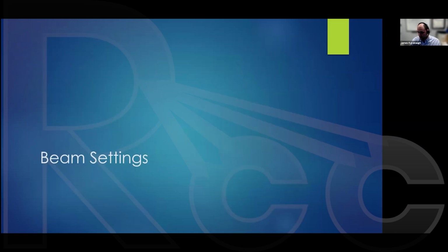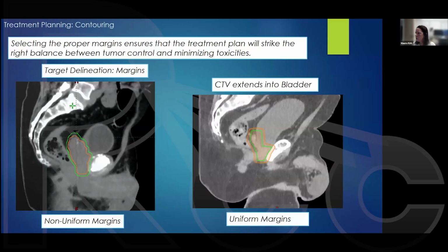All right, jumping into some beam settings, unless there are questions that have popped up. We did have a couple of questions about specifics of PTV margins. There was a question about the posterior margin that you use for the PTV. It will depend on what part of the target it is. So for instance, nodal chains, 5 millimeters is pretty typical, all of it uniform.